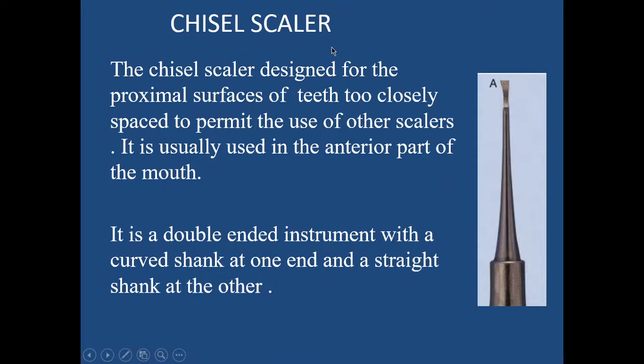Chisel scalers are designed for the proximal surfaces of the teeth that are too closely spaced to permit the use of other scalers.